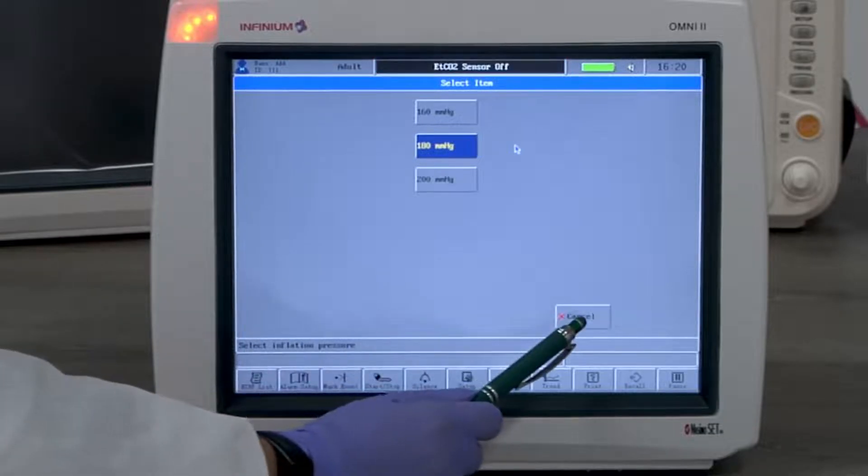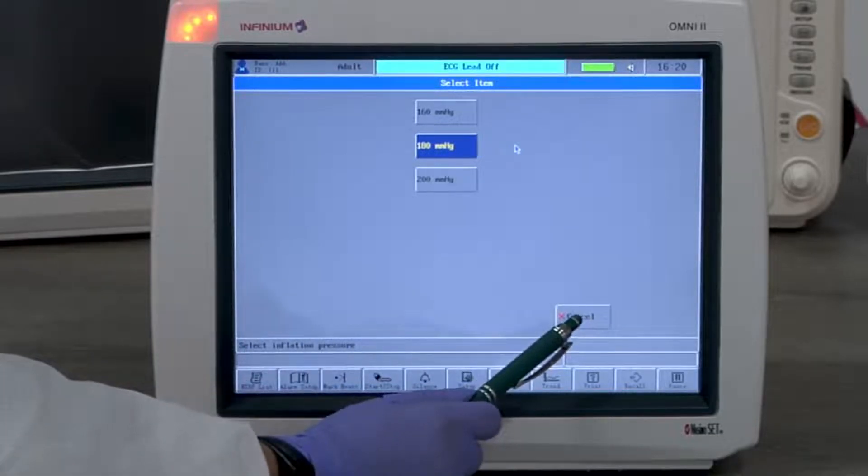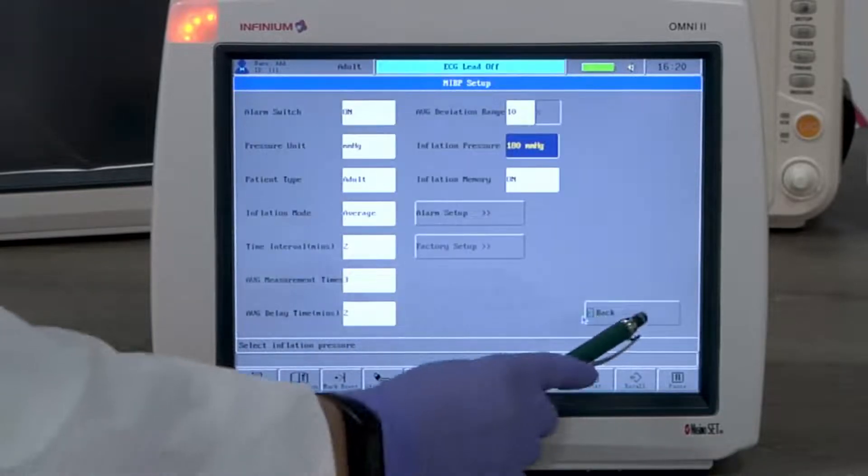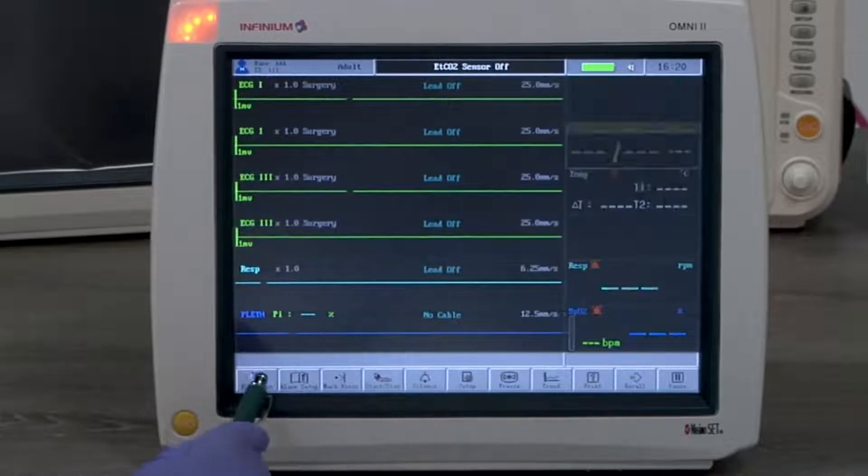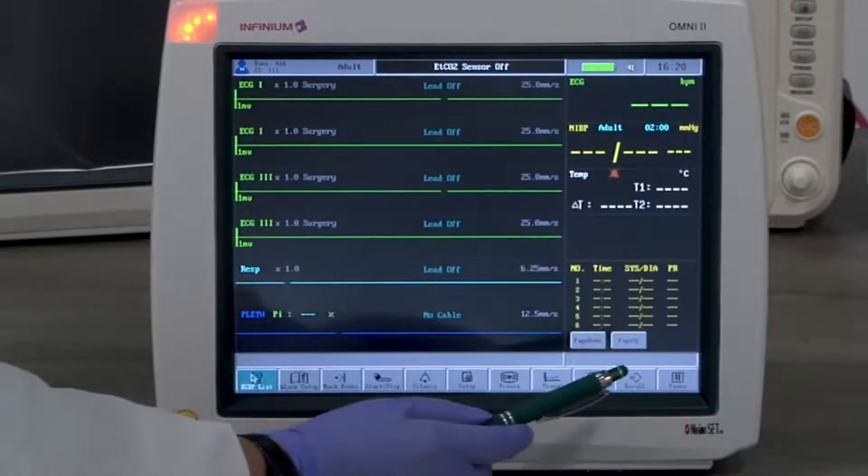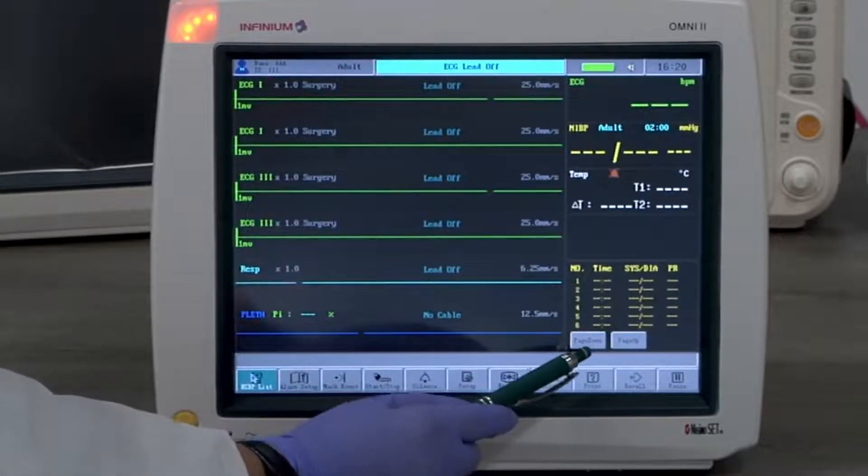By tapping the NIBP list button, you will see the list of NIBP readings. Tapping on this button again will close this window.